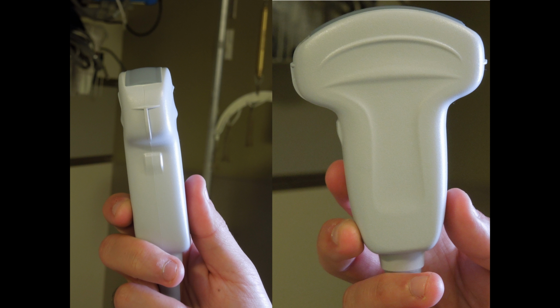So what are you going to use for this? I typically will put my hands first on this probe, and the reason for this is it's so versatile. You can use this on the chest or on the abdomen by simply changing the depth of your image. You don't have to switch around probes. So this is the one that I would suggest using for all of this exam.